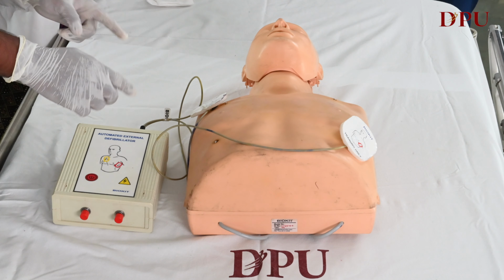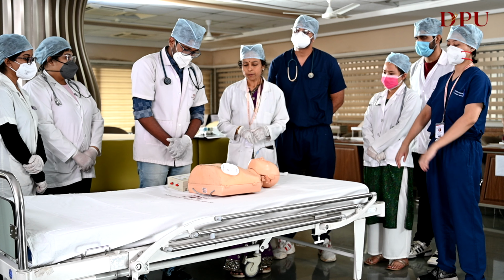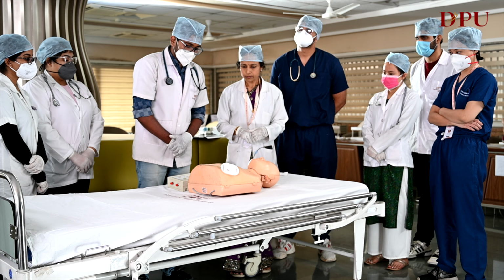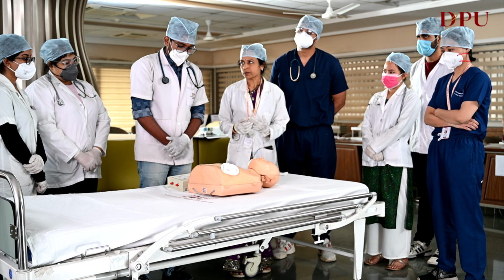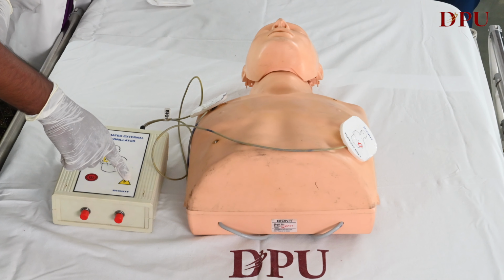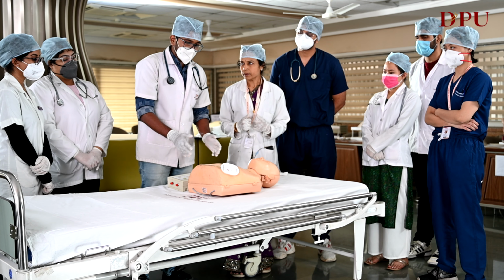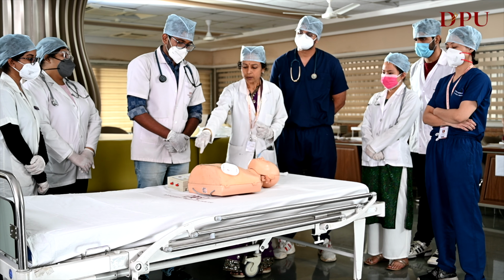Then the compressions are temporarily stopped for analysis. If the shock is advised, the machine will say that the shock is advised. Then the shock is given. Before that you say, I am clear, everyone is clear. Then the shock is given. You have to press the shock button. Immediately after the shock, compressions are started.